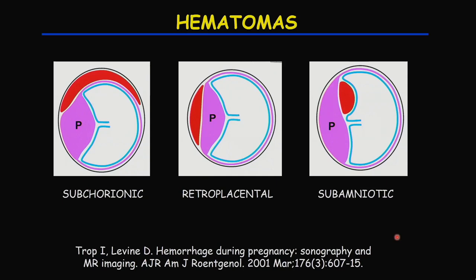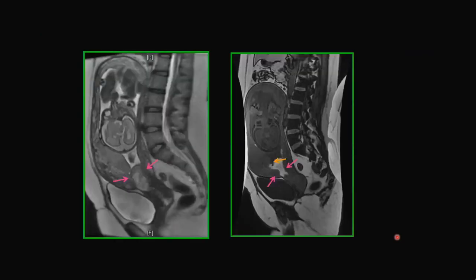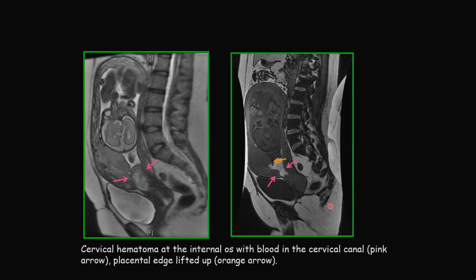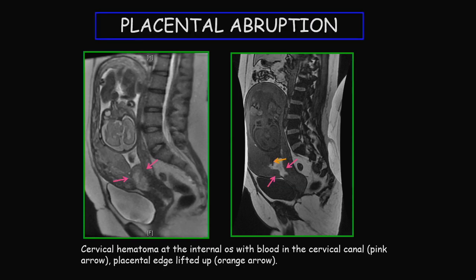I want to show examples of hematoma on MRI. This was a patient where the MRI was performed to look at the placenta. On the T2-weighted image and T1-weighted image, we see a T2 intermediate to bright region above the lower uterine segment. The T1-weighted image also shows this is bright, and the placental edge is lifted up a little bit. This was a cervical hematoma at the cervical os — a small placental abruption — and the patient actually did fine.